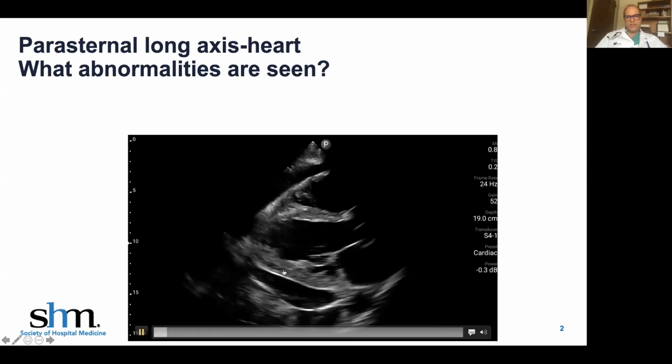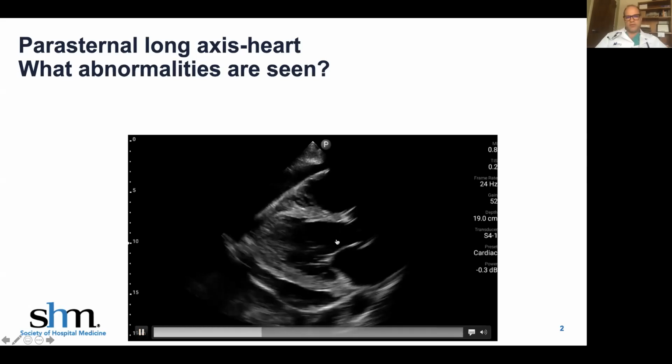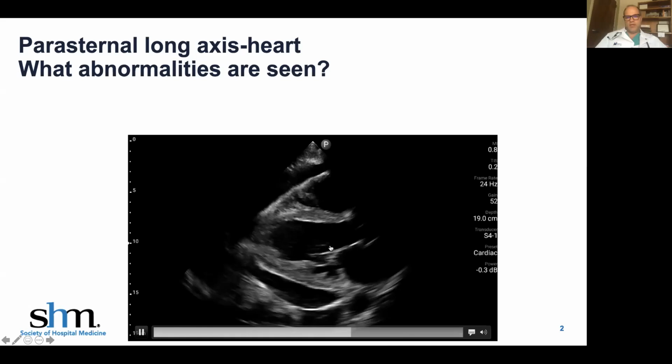He has a poor ejection fraction, probably severely reduced, with a very abnormal EPSS, where the anterior mitral valve leaflet does not come within 1 centimeter or less of the septum here. Here's the centimeter markings on the side. You can also see fluid collections behind the heart here, and a bright line and another fluid collection back here, and fluid up in this area.